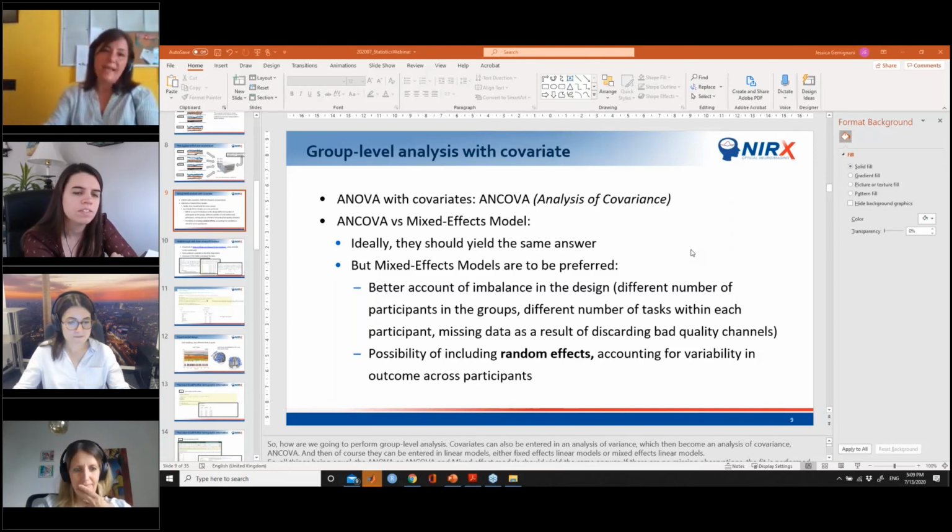So basically, the dummy coding is only a scheme to tell the model that the factors are actually categorical, and that there is a level that is going to be taken as the reference level, because of course it's still a linear regression, so it's going to try and find differences between the two levels.